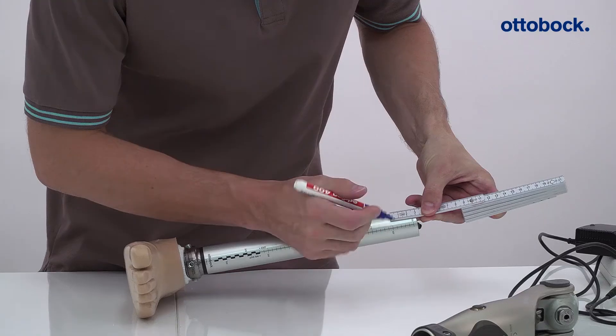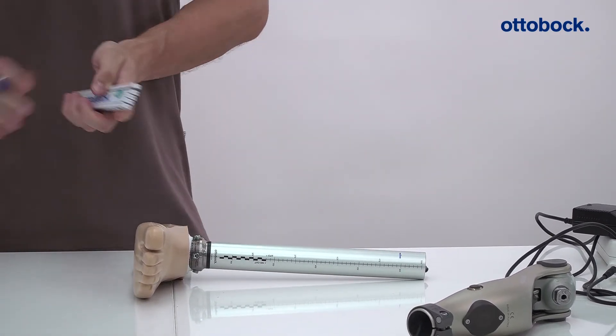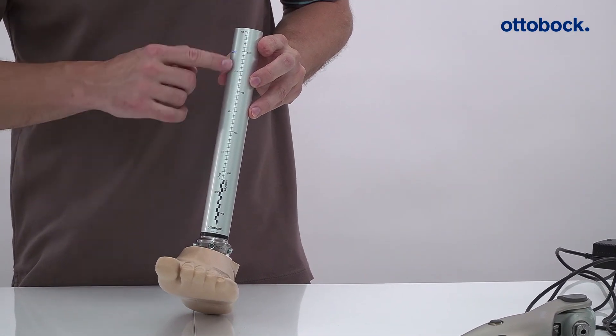Then disconnect the axon tube from the Kinevo and mark the calculated difference. Take note of the no cut and cut areas before cutting the tube to length.